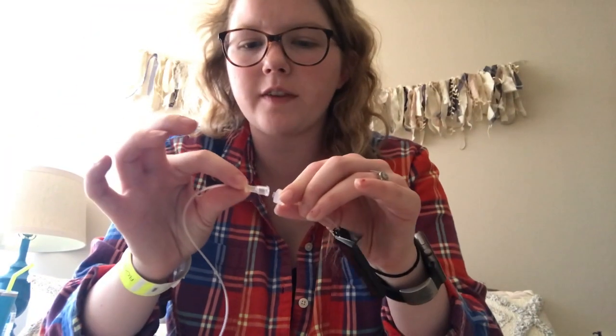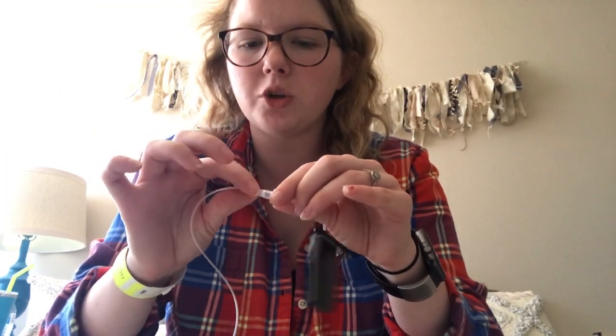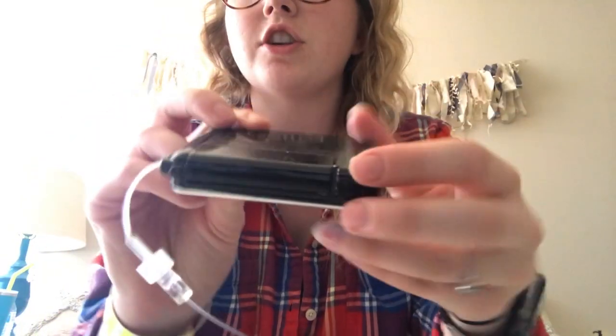I'll twist and make sure they are connected and really secure, because if not they can come disconnected and you can think you're getting insulin and you're not. Before you know it your blood sugar's in the 400s — speaking from experience. You can see the cartridge in there.